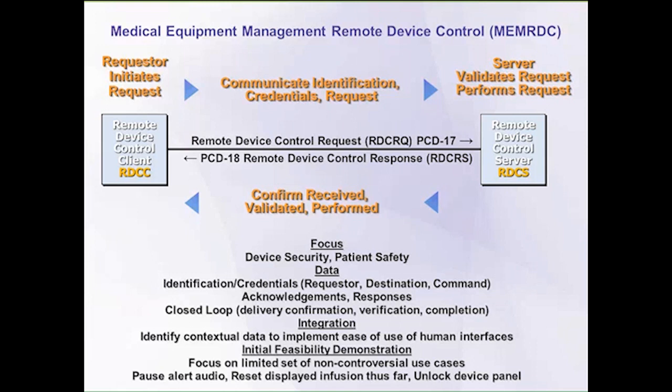The reset displayed infusion thus far is a matter of logging. Clinicians have to go to the devices and make note of the amount infused thus far. And in order to remind them to do this, there is a means of resetting on the display how much has been infused thus far, so that you can have sort of a waypoint along the way. But this provides a means of not only resetting the displayed infusion thus far, but also returning status, that device response, which says, I've done that, and here's the checkpoint that I was at when you asked me to do that. So you can log that information, so you have a record. So it kind of dovetails into the previous profile I discussed called IPEC. So you have infusion event communication.